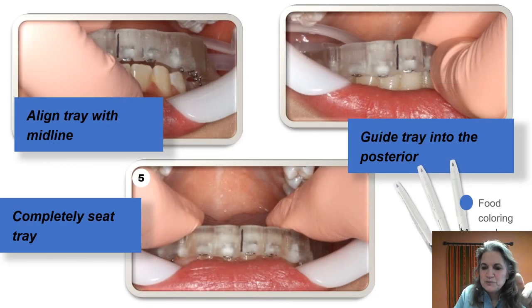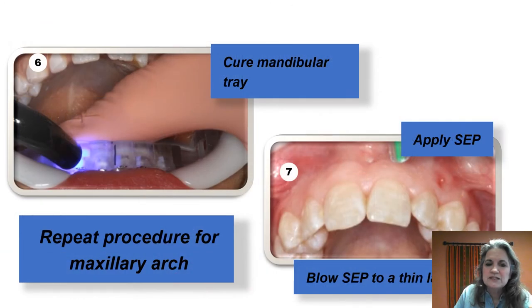We've etched both arches, but apply the self-etching primer one arch at a time — they like to start with the lower. Before applying the self-etching primer on the lower, remove that tongue guard so it's easier to slide the tray. You've got that midline mark, so line up the midline, seat the posterior, then the anterior. Once seated, do a tack cure to hold it in position, and then staff will go ahead and do a final cure.